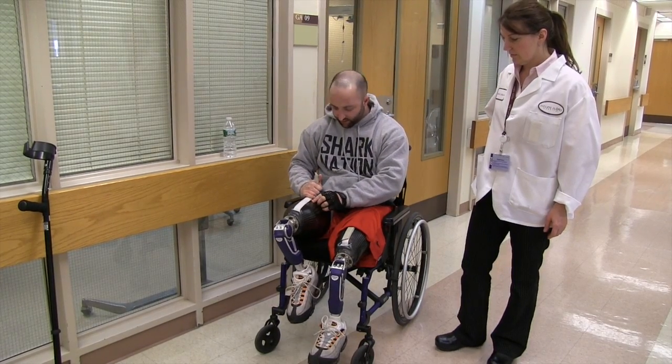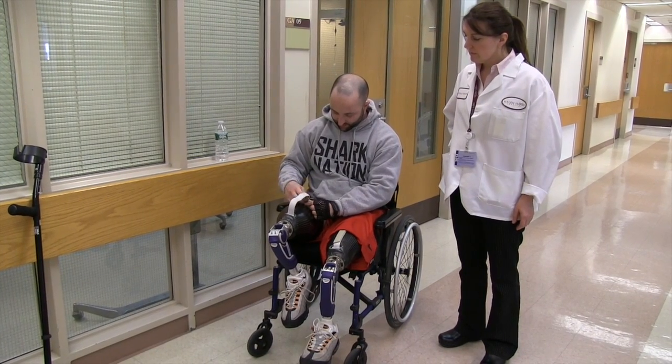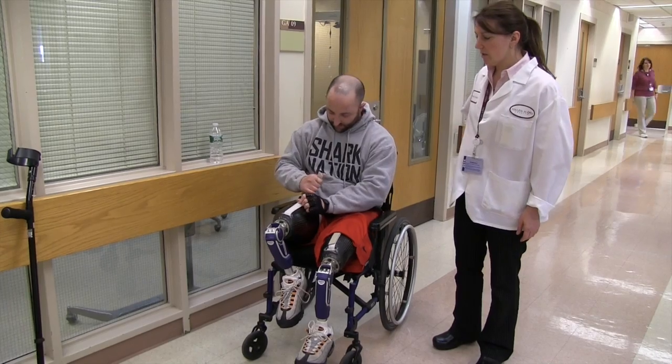This one is turning in a little bit. Which one is turning in? This right one. One to the left. The right one was usually okay.